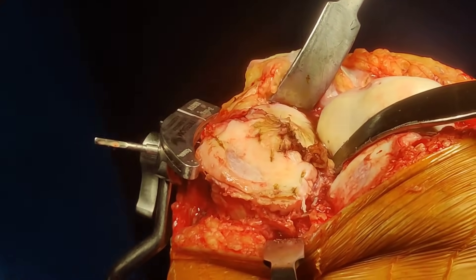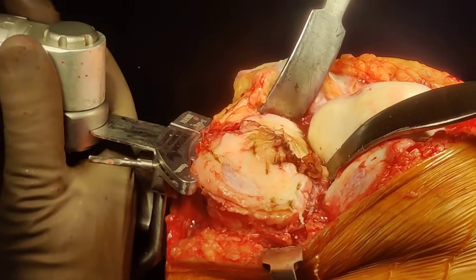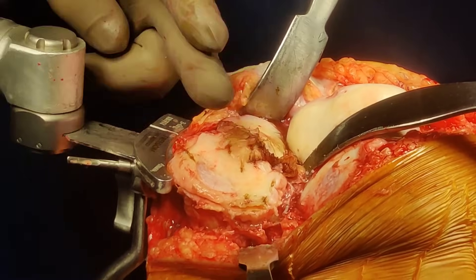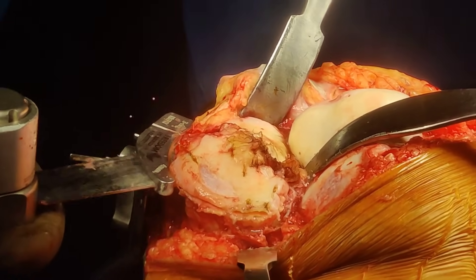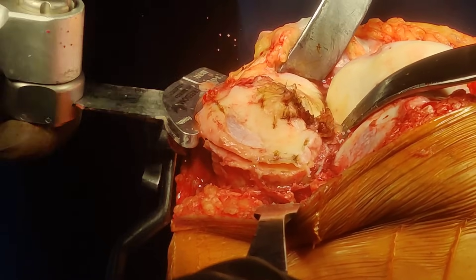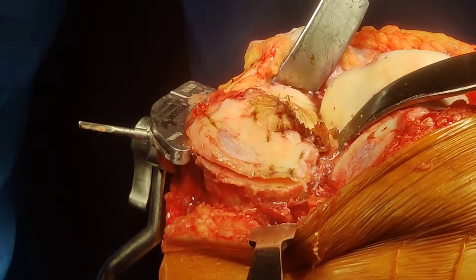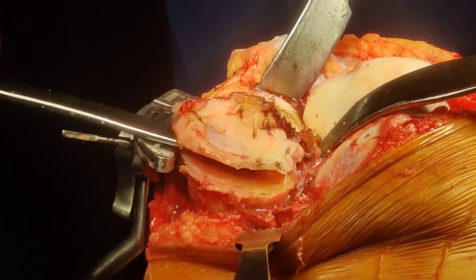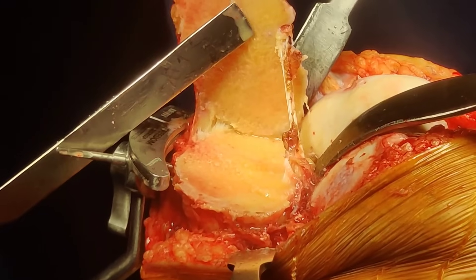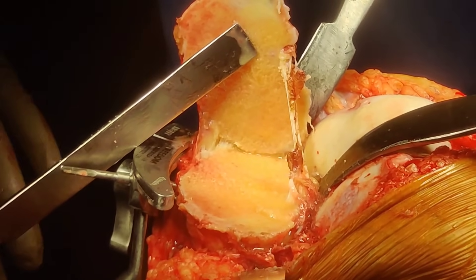As you gain confidence you can keep going. The sequence is: first at an angle, second straight, then third again at an angle. Once you have done this, take an osteotome and if you've done a good job it will just lift like this. So the tibial cut is done. For the tibia, your saw has to be upside down, not straight.